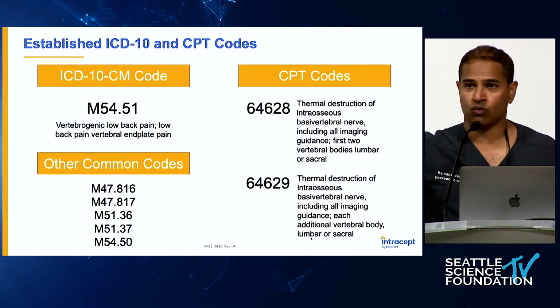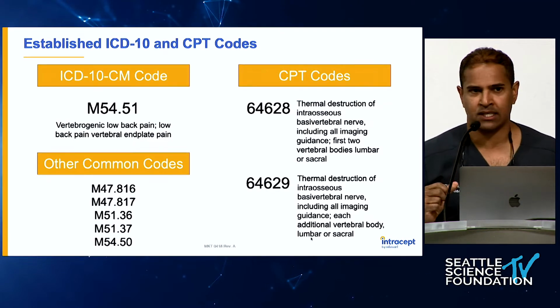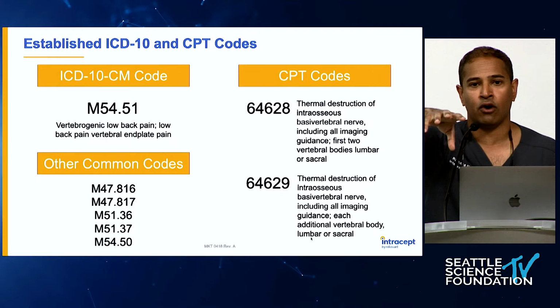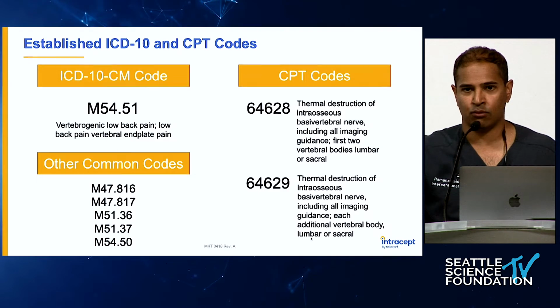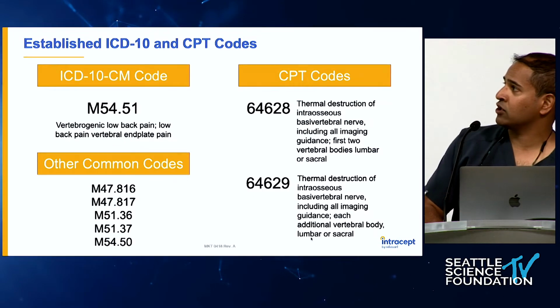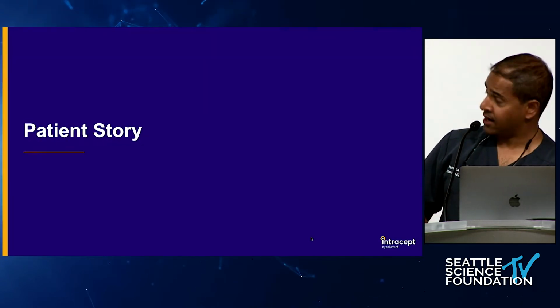There are situations where you have an L4 through S1 fusion, and an L3-4 disc is burned. Could you do L3 alone? Yes, and you justify you could bill 64628 if you can't get by the hardware. But Doug or I will do extrapedicular, or ask the surgeon to remove the pedicle screw and then go ahead and do it. So these are things we can talk about offline. If you have any questions, feel free to ask us afterwards. And I have a few minutes.